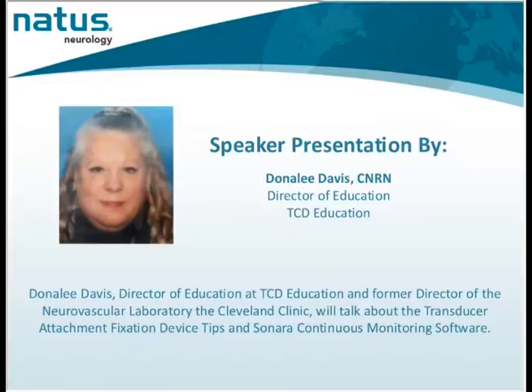Thank you, Katie, for that warm welcome. I appreciate that. I am going to talk to you today about continuous monitoring using the transcranial Doppler technology. With TCD continuous monitoring, you must use a dedicated transcranial Doppler.